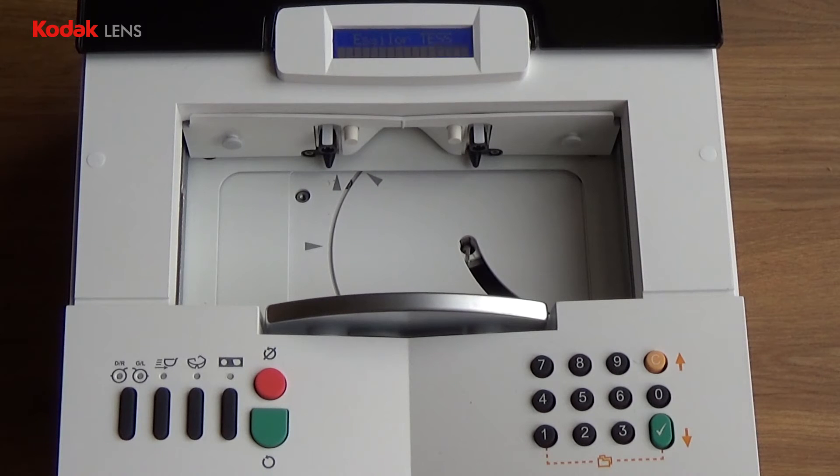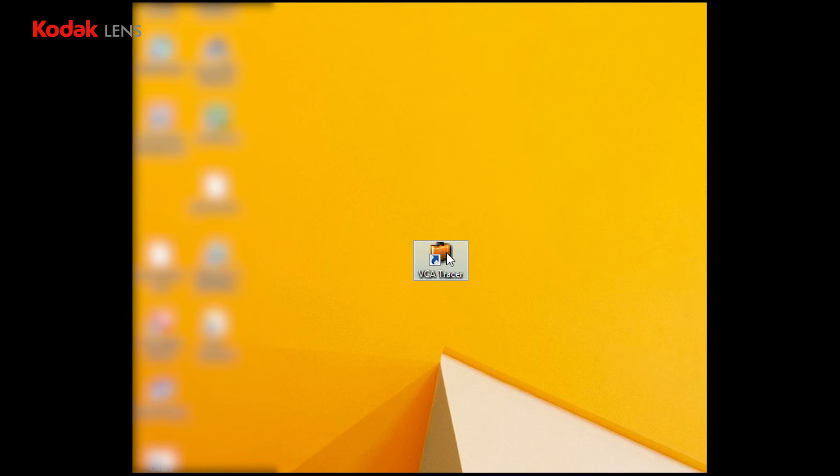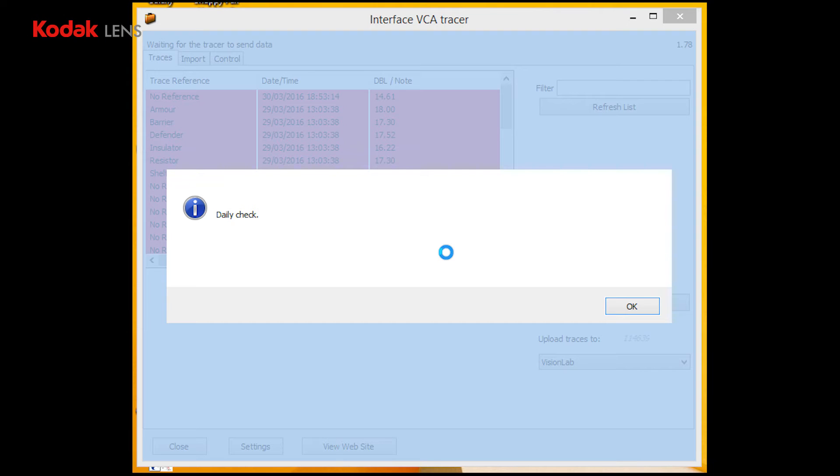Once the tracer is ready, you'll hear two beeps. It is recommended you allow the test tracer approximately 20 minutes to warm up. Now start the VCA tracer program located on your desktop. You'll now be asked to carry out the daily check.